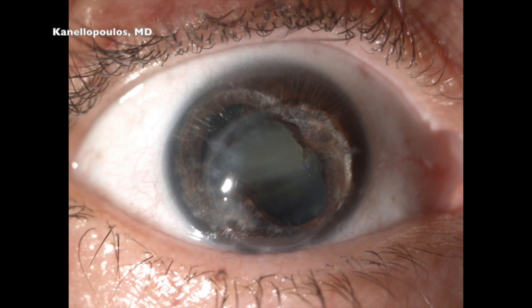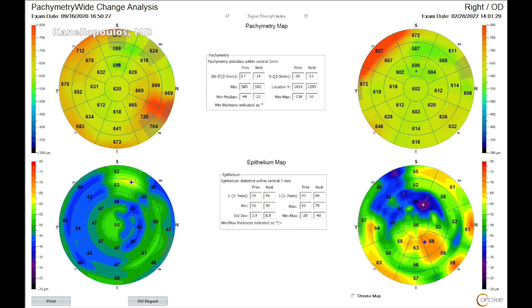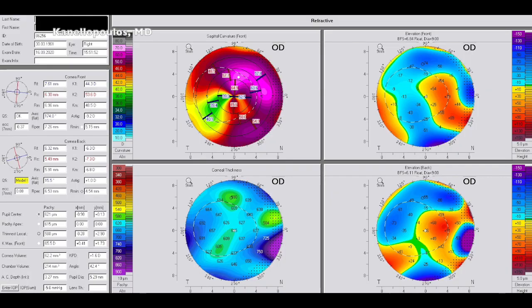Fortunately, the lens, although this accelerated the cataract formation, was not injured. We can see that removing the sutures and treating through the anterior surface between 20 and 22 improved dramatically the anterior segment OCT maps. The challenge here is calculating for an intraocular lens.